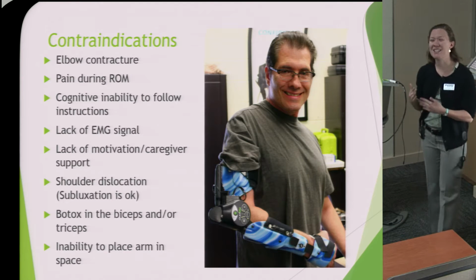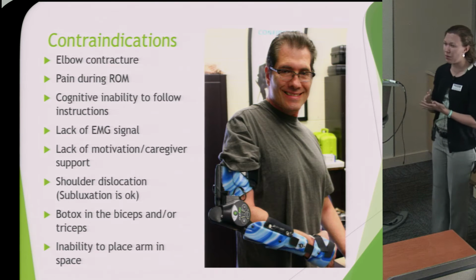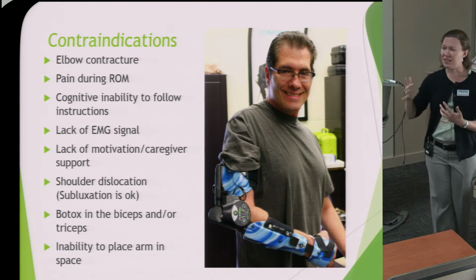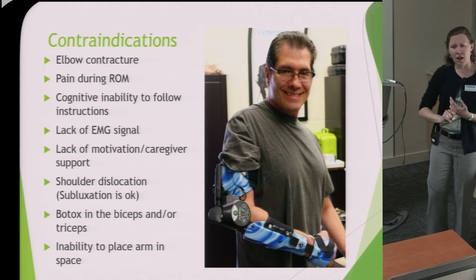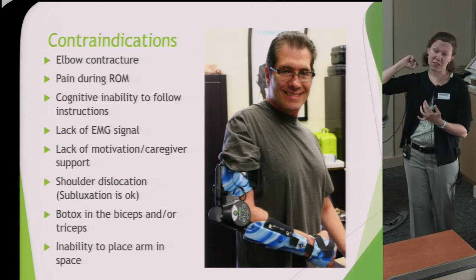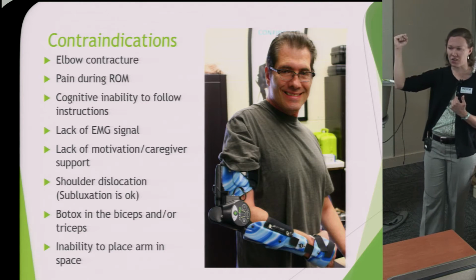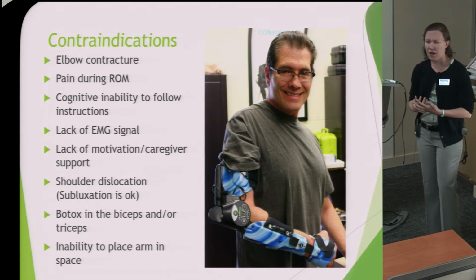Who is this not indicated for? Patients who may be candidates for a MyoPro do not have an elbow contracture. We can work with a contracture of about 10 degrees or so, but much beyond that, it becomes problematic. This motor is designed to power from 0 degrees full extension to 130 degrees full flexion. So because of that, if they have, say, a 90-degree contracture, it's going to try and push through that. It's going to be very uncomfortable for the patient.